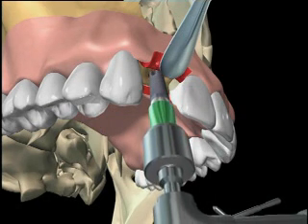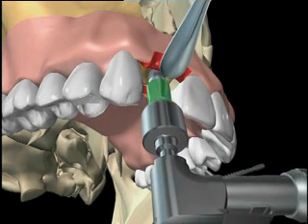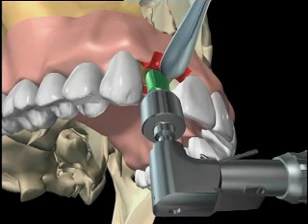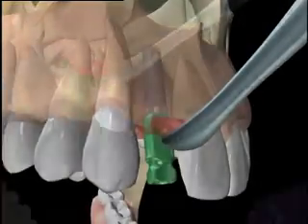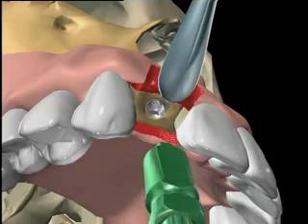The tapered screw vent implant features triple lead threads, which allows the implant to seat with 1/3 of the revolutions required to seat an implant with a typical thread pattern. The flat of the fixture mount, which corresponds to the flat of the internal hexagon, is aligned according to the presurgical model used to prepare the abutment.